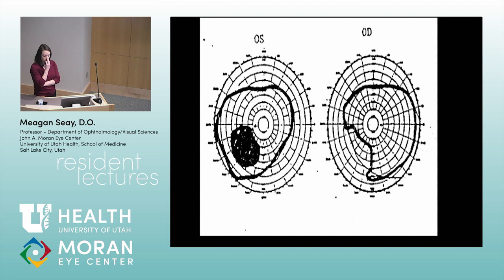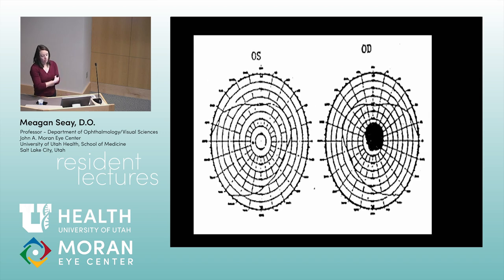About this one. It's like a left inferior quadrantanopia. So like right parietal, or right parietal and behind that. It's a right superior occipital. Right central scotoma. Anterior to the chiasm, yeah.